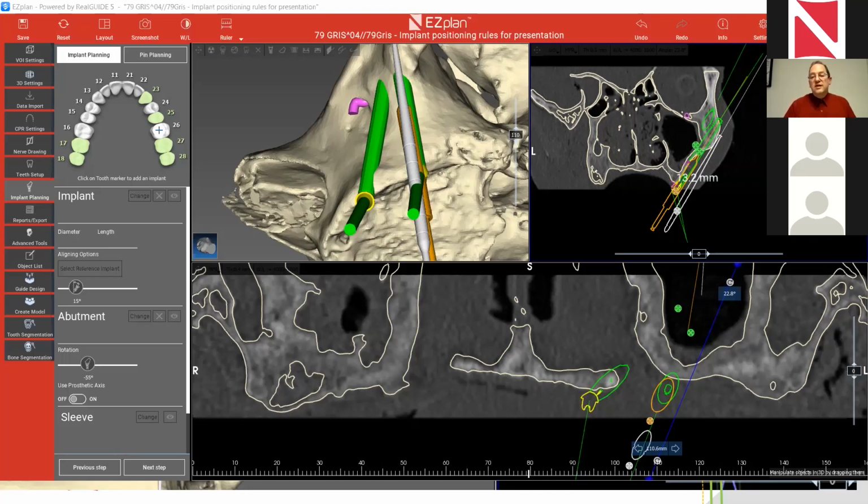So if we did it freehand and the zygomatic implant was positioned correctly and the zygomatic bone was long enough and so on, this implant could hold many years, much more than 5 years. Unless, as I said, there might be some complications in terms of sinus or whatever.